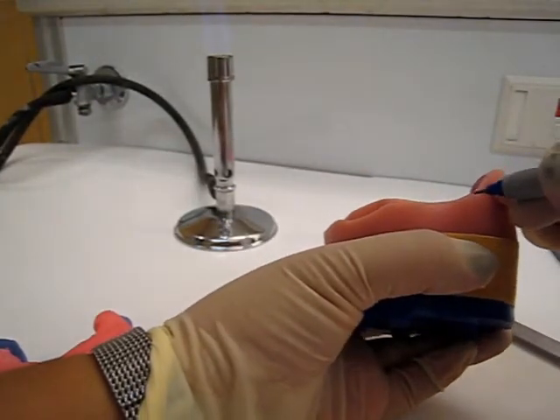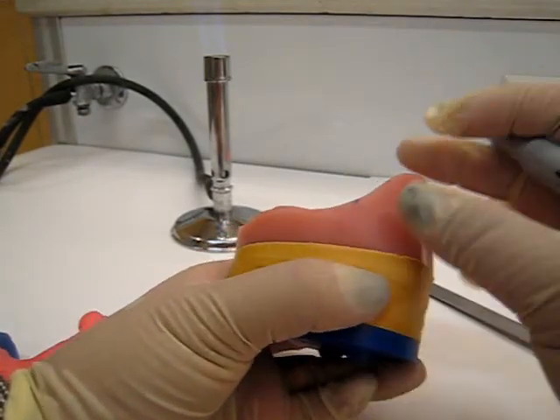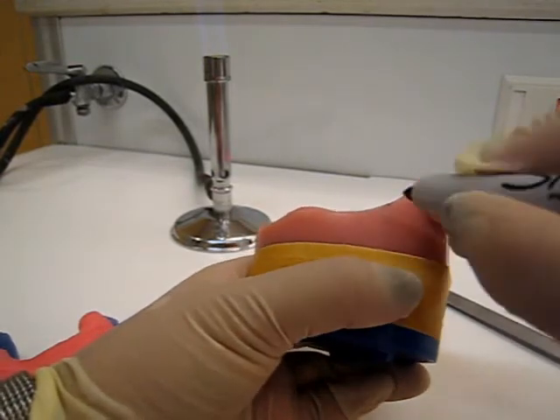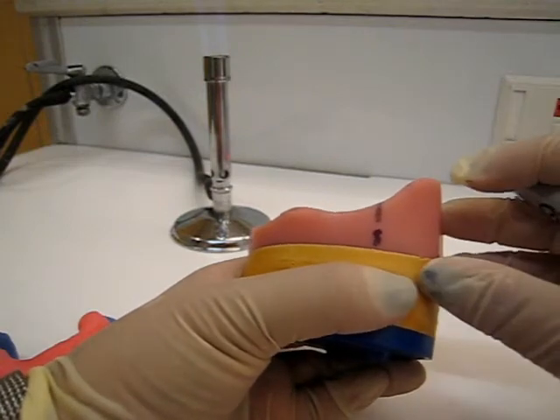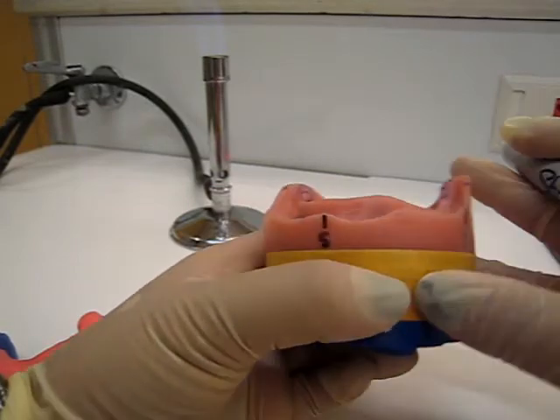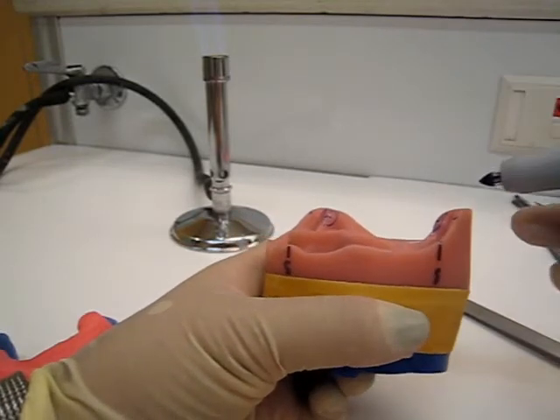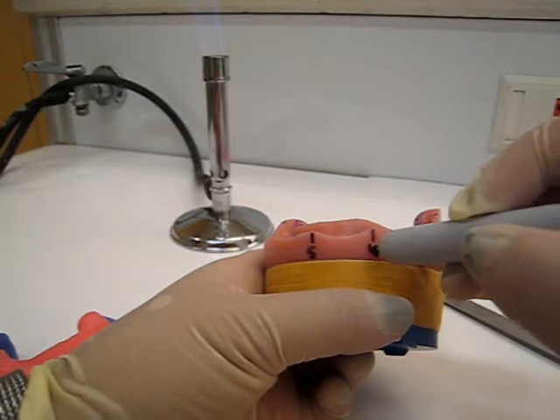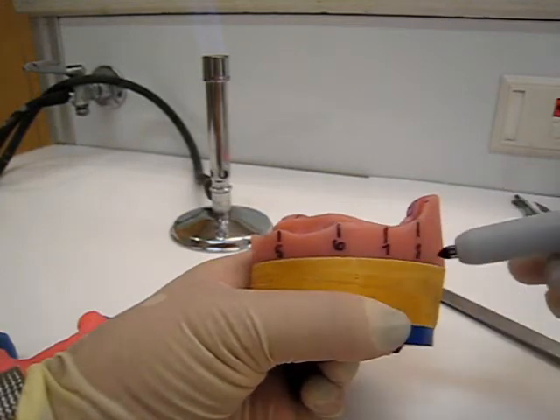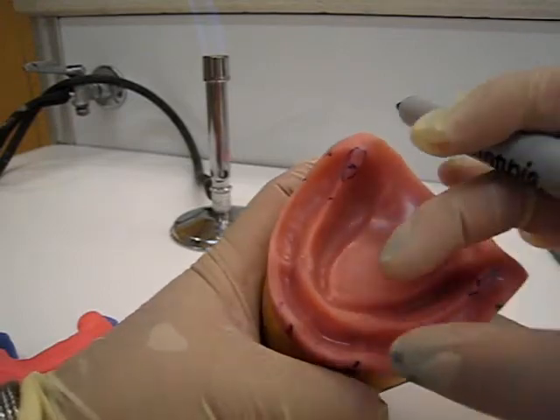Keep in mind the posterior extent - when you measure your occlusal rim, this measurement is supposed to be 8 millimeters across, and the front is going to be 5. The trick is to taper from 8 to 5. At the canine region I estimate about a 6, and at the premolar region I estimate about a 7. The 6 and 7 aren't required measurements, but they help guide you to taper nicely from 8 to 5.